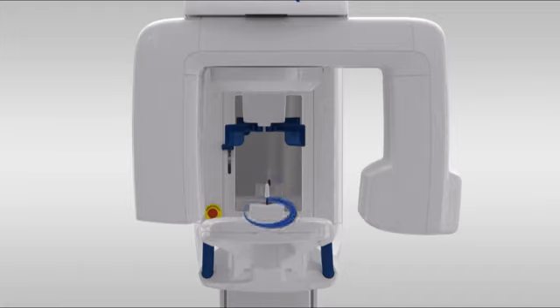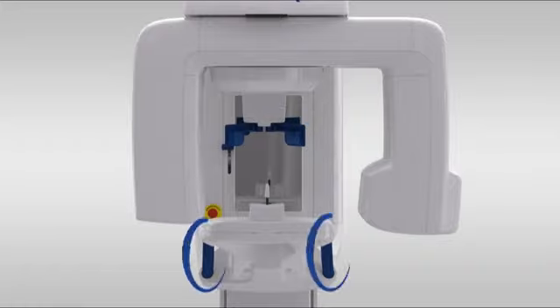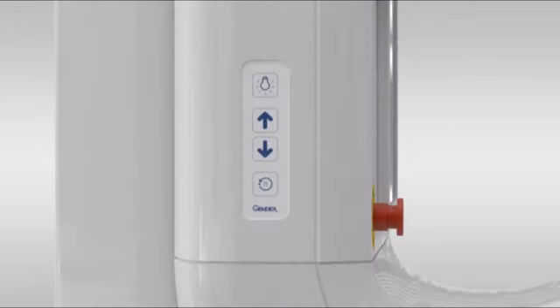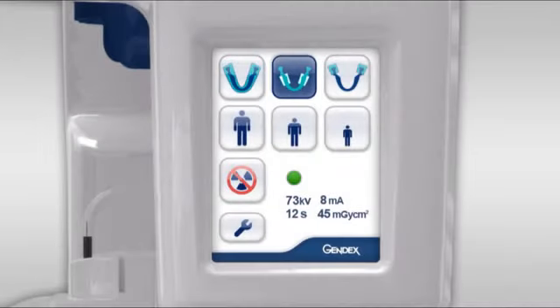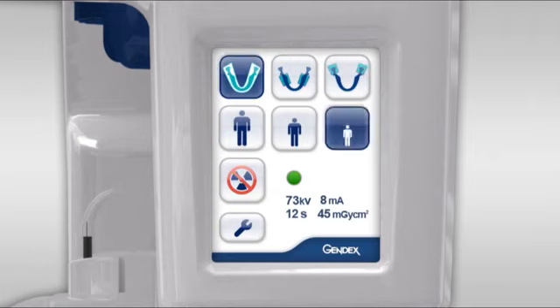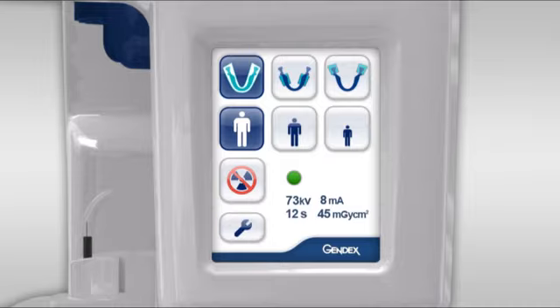chin rest, head supports, hand grips, and positioning lasers. Finally, the exposure trigger, which either may be a handheld device or wall unit. The column control has the laser alignment lights button, up and down buttons, and a reset button. The touchscreen selections include projection type, body size, no-dose simulation, and additional settings. Displayed are system status and dose information.